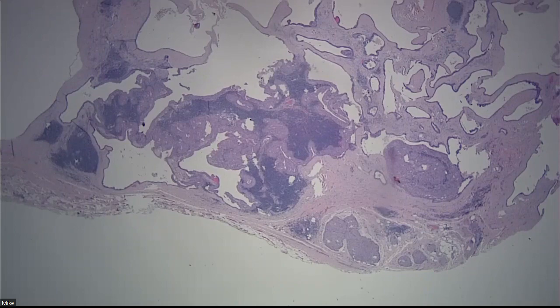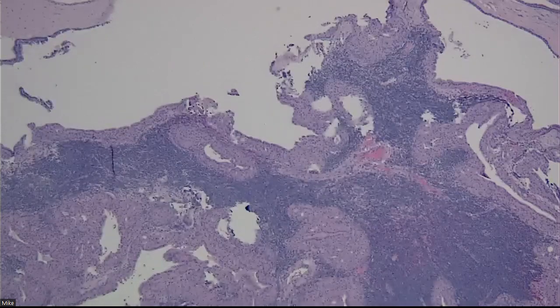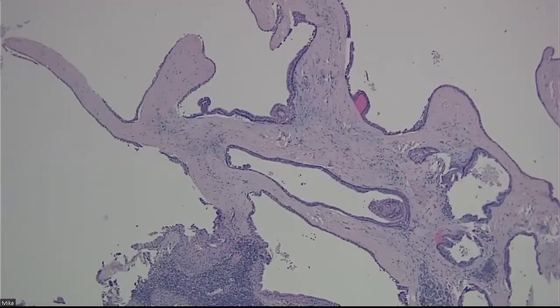You can clearly separate it from the adjacent parotid. It always has this lymphoid stroma, and it generally is a bilayer of oncocytic epithelium that sometimes becomes a little bit proliferative, like you see up there. But if you look in the lining here, look at that lining there. It's usually bilayered and oncocytic. Nuclei kind of orient themselves nice and linearly, right? You can see them, right?